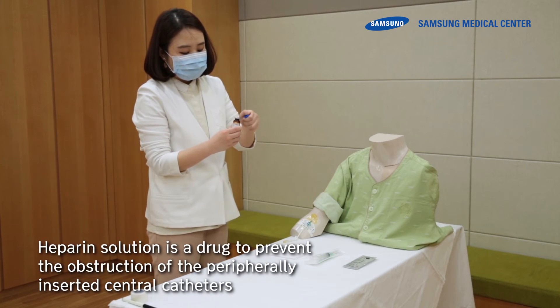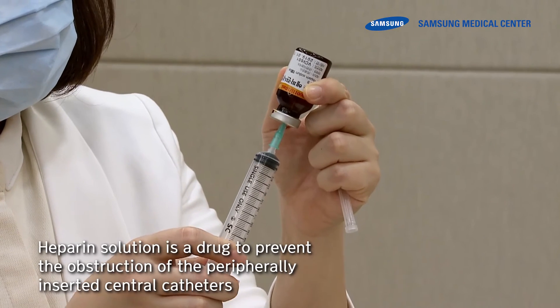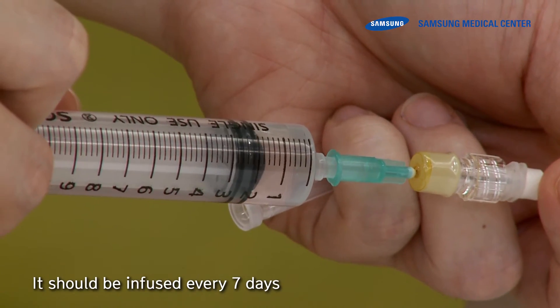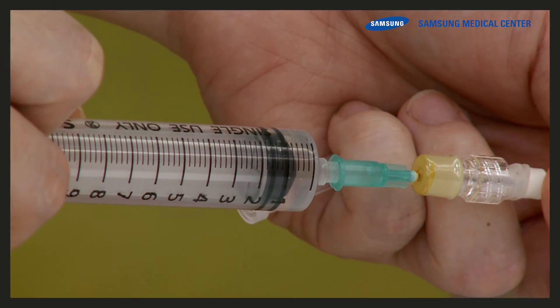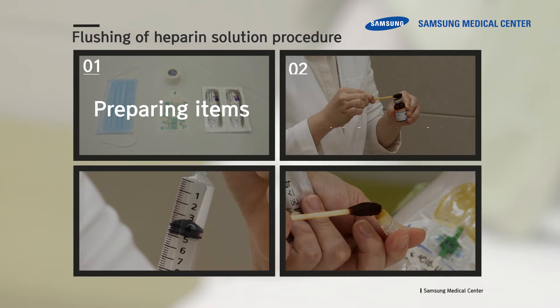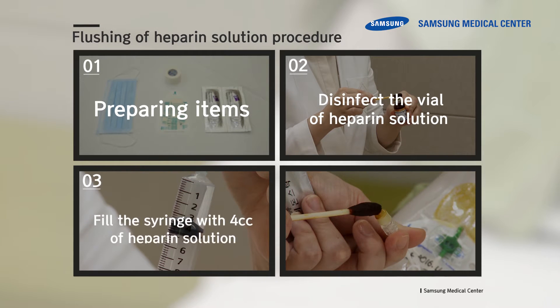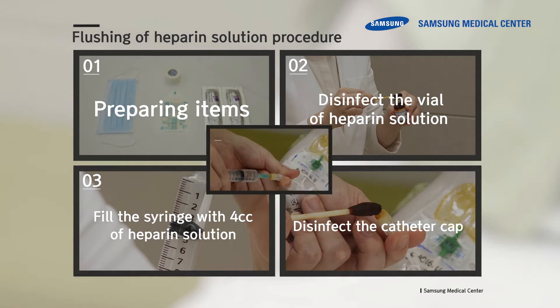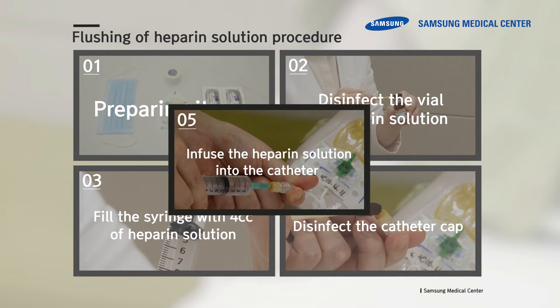Heparin is a drug used to prevent obstruction of the peripherally inserted central catheter. It should be infused every seven days. The heparin infusion procedure involves the following steps: preparing items, disinfecting the vial of heparin solution, drawing the correct dose of heparin into the syringe by pulling back on the plunger, disinfecting the catheter cap, and infusing the heparin solution into the catheter. Let's check out the heparin infusion procedures in detail.